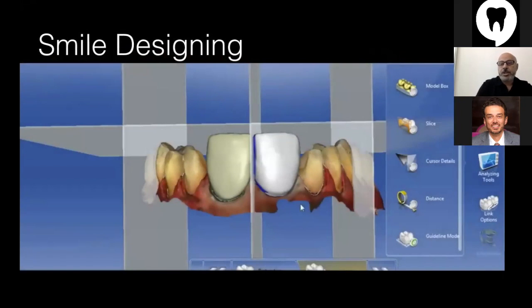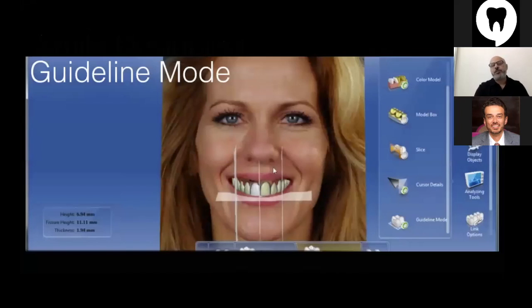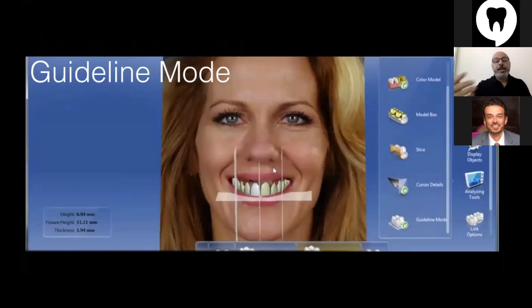On the CEREC software, for example, you have a smile designing module. You can do everything with your software. You can design according to the facial parameters. You can take a picture of your patient and then introduce it inside the software. Even you can do a face scan. If you want everything to be 3D, you can do a face scan.